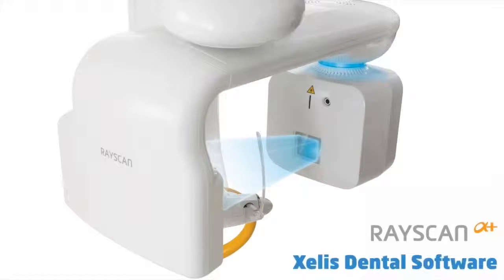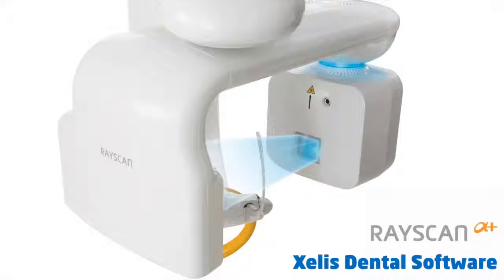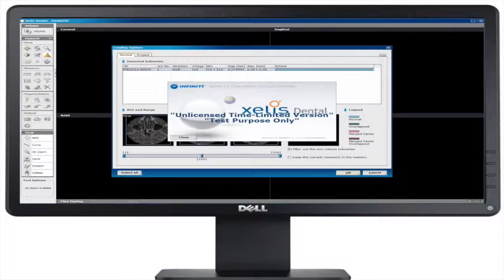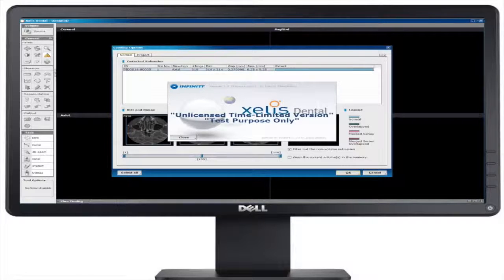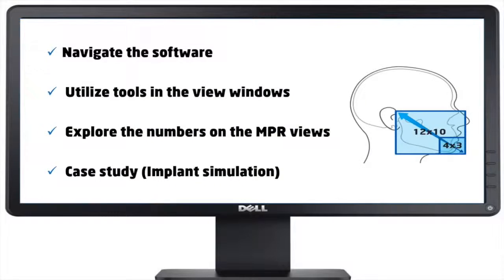Introducing Jella Stantil Software. This video is designed for new employees, self-paced training, and provides how to manipulate the 3D viewer scan from RayScan Alpha Plus. By the end of this video, you should be able to navigate the software, utilize tools in the view windows, and explore the numbers on the MPR views.